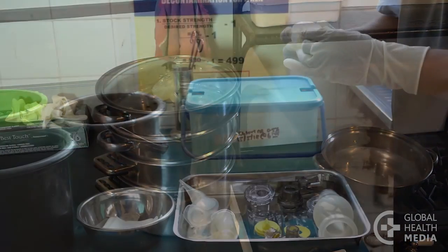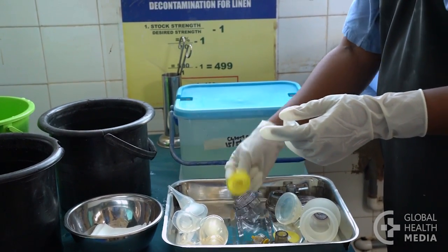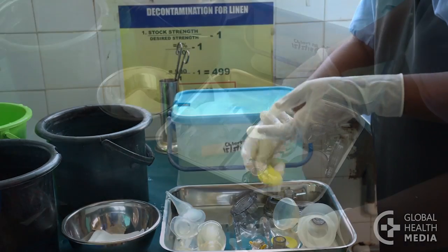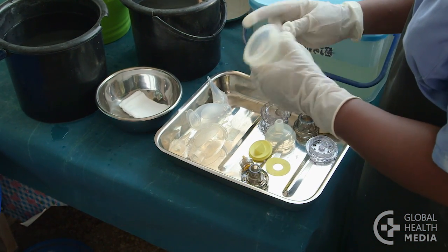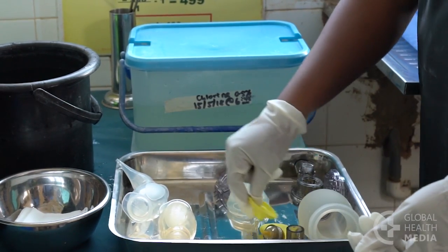Now you've disinfected the equipment. Wearing sterile gloves, inspect each piece for damage, and then count the pieces for each ventilation bag. Repeat the cleaning process if they are not clean, and replace any damaged or missing parts.